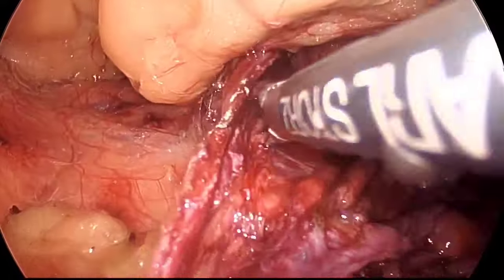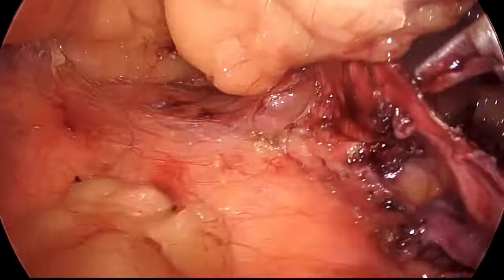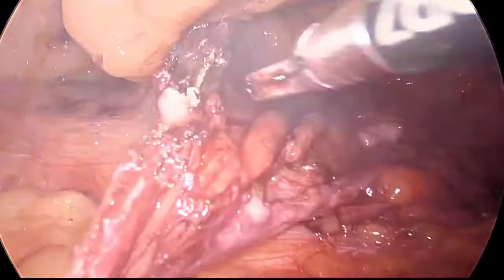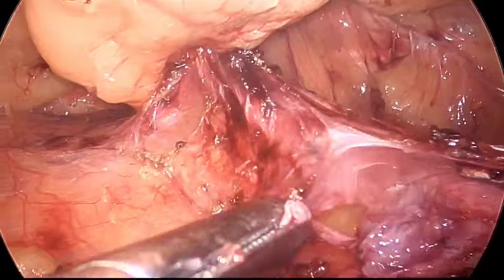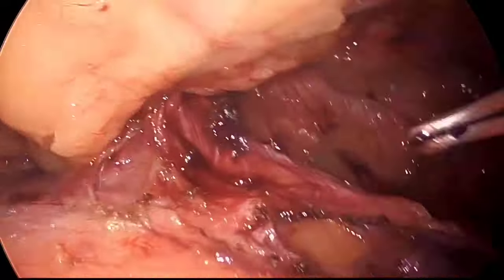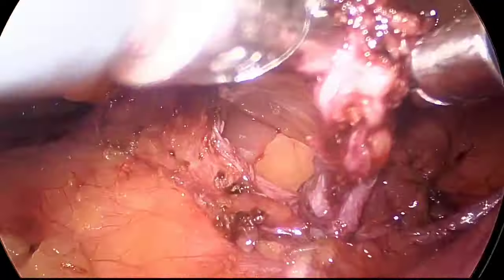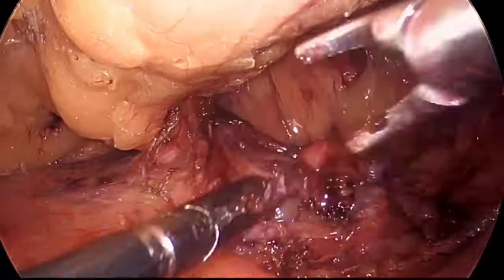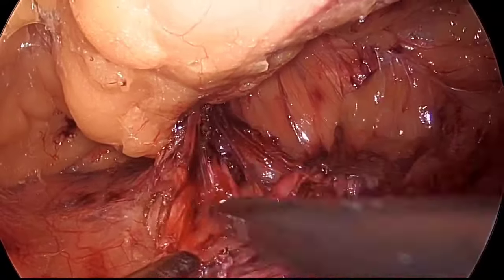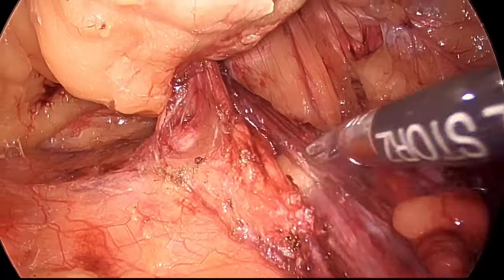This sac was almost dissected, safeguarding the gonadal vessels. Now I am reflecting the gonadal vessels towards the parietes. This is the margin of the sac, so complete division of the sac has been done. And these are the gonadal vessels which I'll be separating with my Maryland forceps, and the vas deferens is also visible.